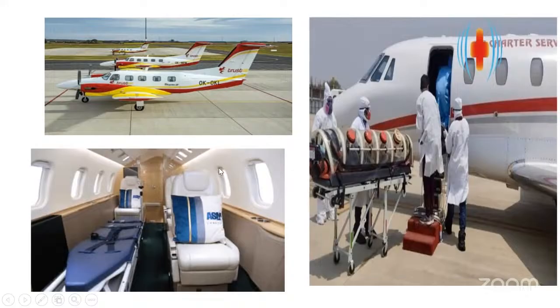Long tubings have to be kept so that even if the oxygen cylinders are down, we can shift the patient inside. So long oxygen tubings are required. Then the height may be somewhere around 4 feet, so you have to lift the patient. You'll need multiple support staff to transport the patient from the tarmac to the air ambulance, and vice versa. So all these things become very challenging when you're shifting the patient on ECMO.